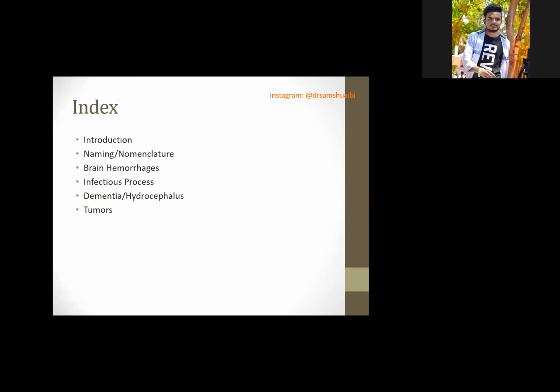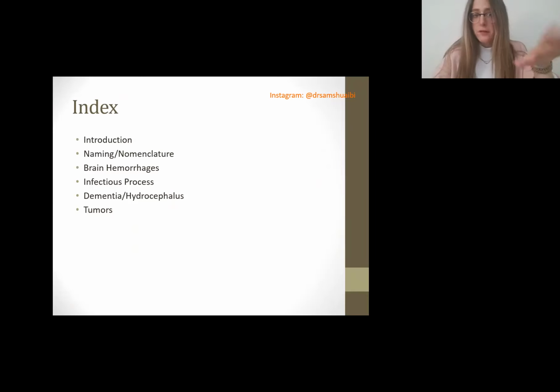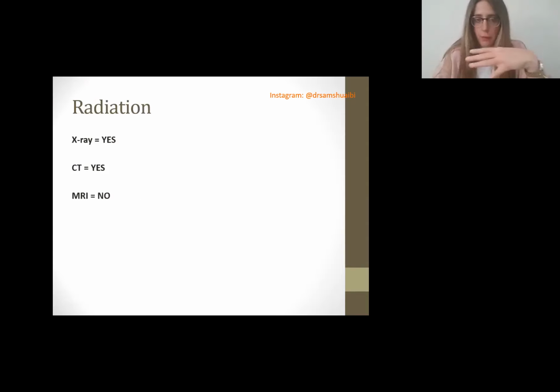Anyway, this is what we will be covering today. We're not just going to be covering brain hemorrhages, infectious processes, hydrocephalus, dementia, tumors, only the high yields that come up on your exams. And I'll also be giving you some tricks during your ward rotations that will help you out. First of all, just a brief overview. I don't want you to get out of my lecture just knowing high yield stuff. You need to know some background about this topic.